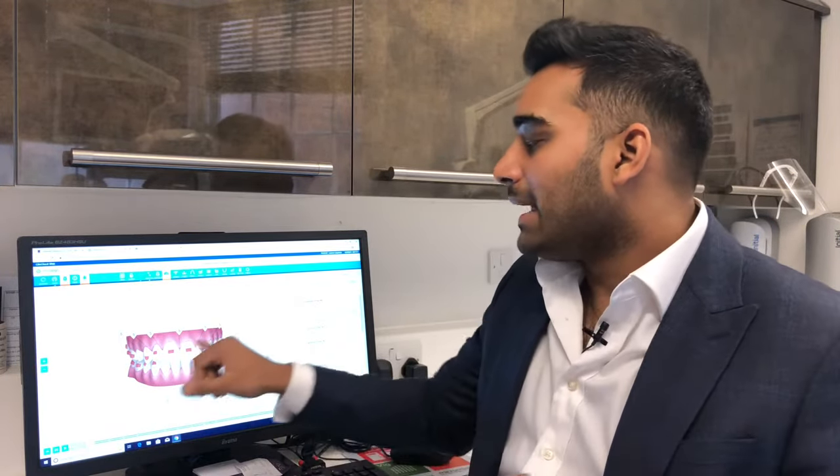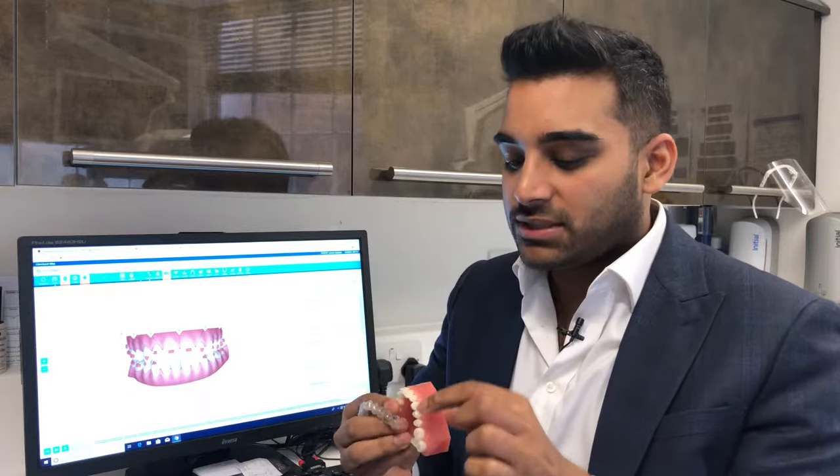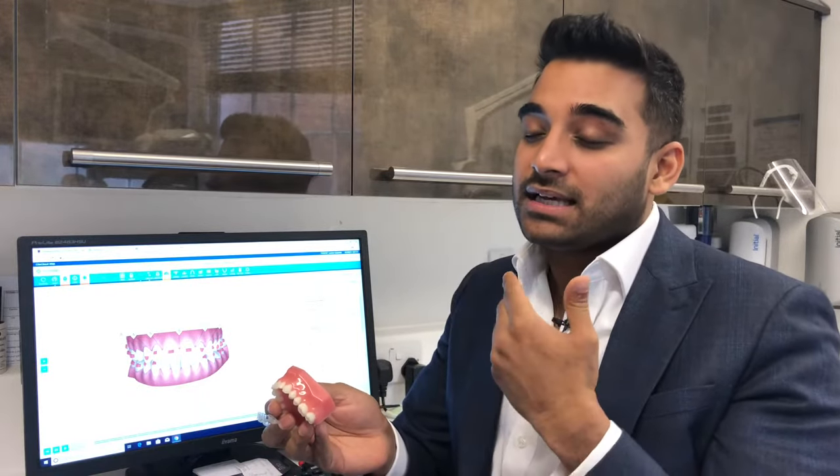As part of the treatment you may need little attachments, which are little white composite buttons attached onto the teeth. These direct forces in certain directions to align certain teeth.